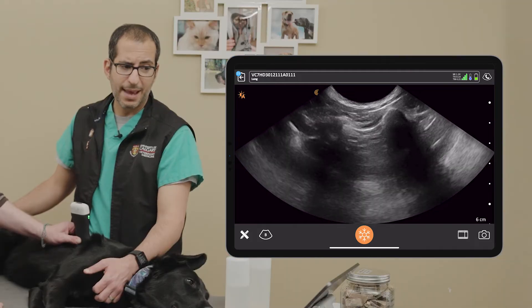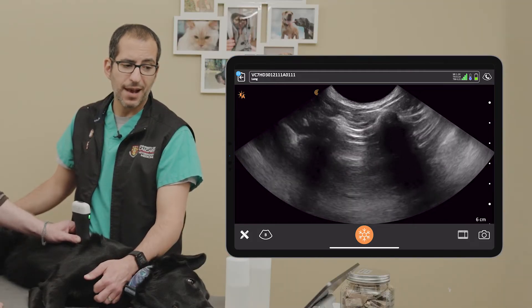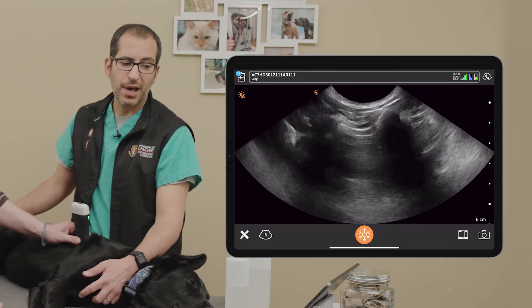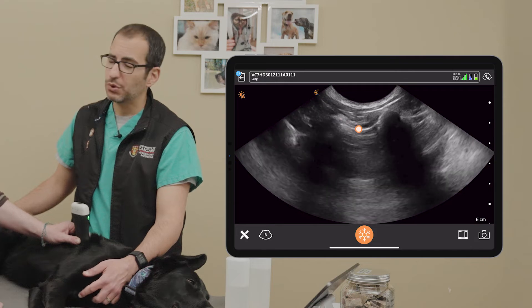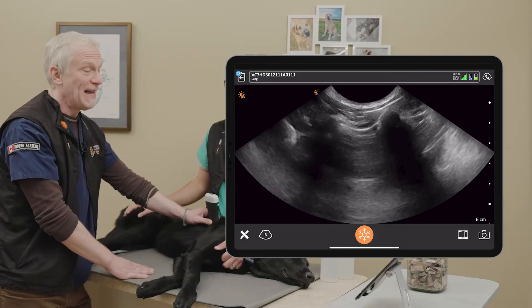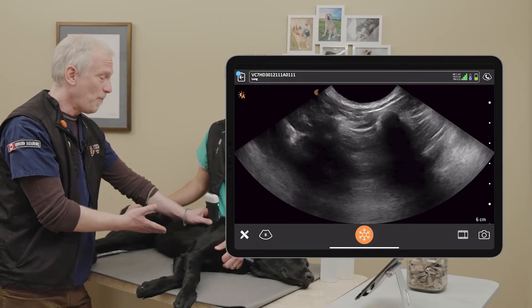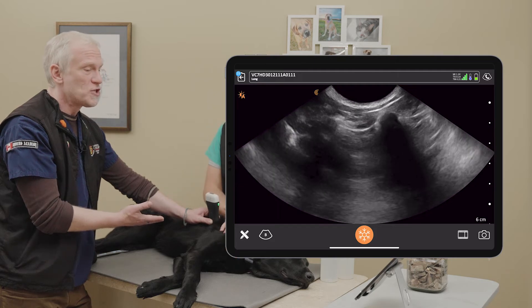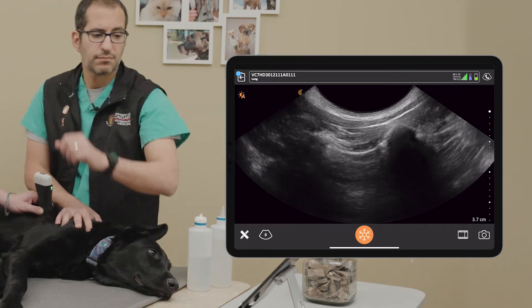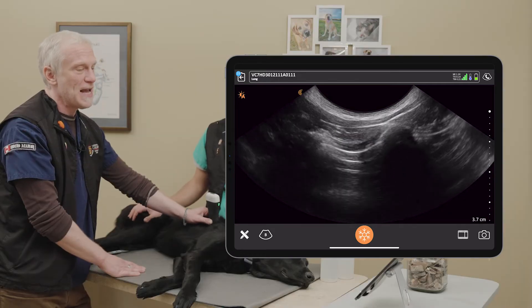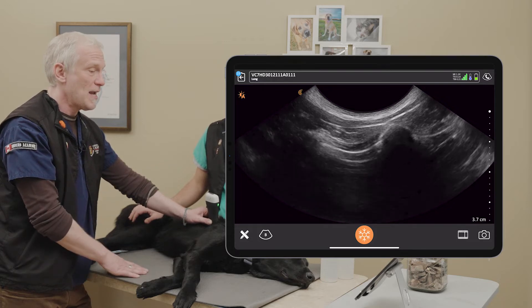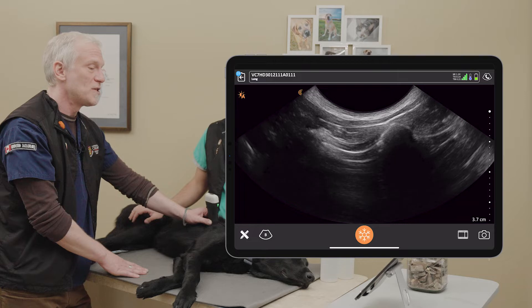The bat sign is identified by two rib shadows with the body of the bat in between — that's the pleural line, the most important thing to identify when doing PLUS scanning. In this case, our patient Penny has a very thin body condition score, so we'll take the depth down a little bit by simply sliding it on the touch screen. Now we have a nicer, blown-up image, and we can see the pleural line — the body of the bat — the first white line below the ribs that joins the rib shadows.